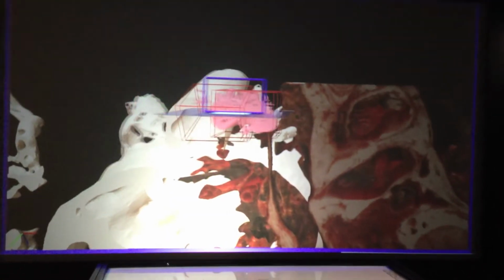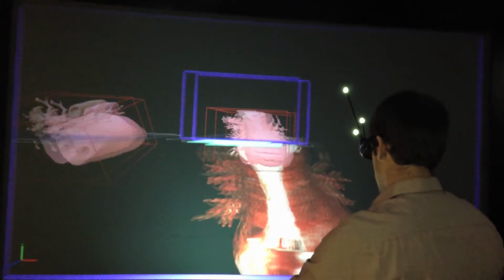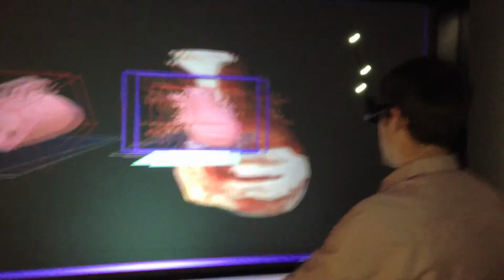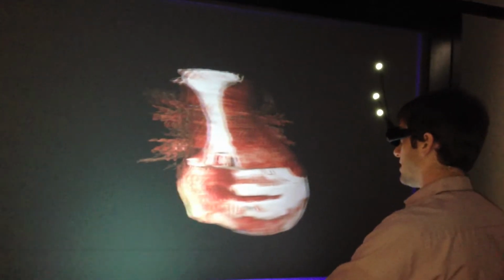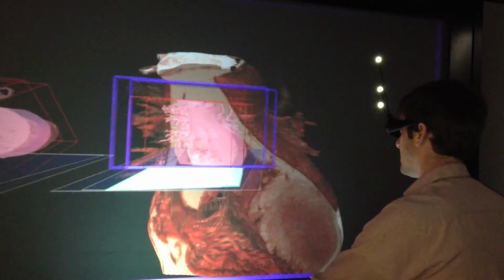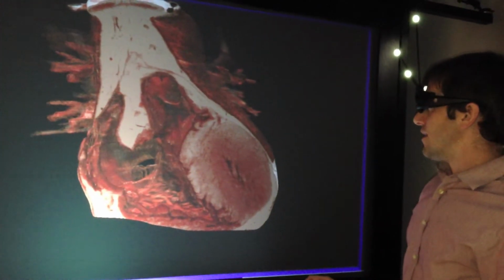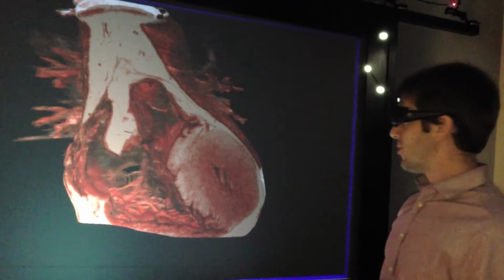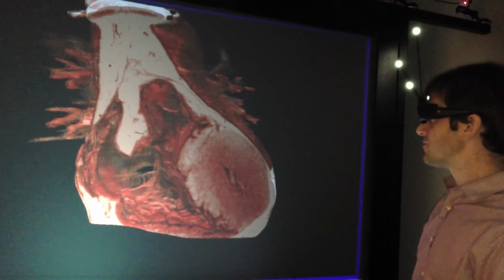Okay. Help me understand what the advantages of a tool like this are. A tool like this can be used, one, for understanding, just learning anatomy. Here's a heart, what does it look like inside, and dive right in, look at the internal structures. So learning is step one. Then, if you've got multiple ones of these, you can do comparative anatomy.